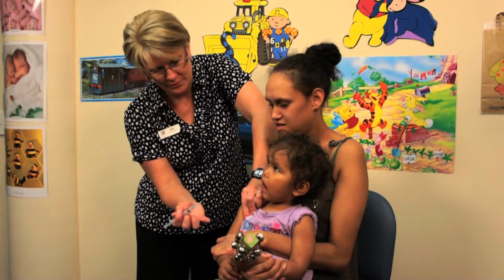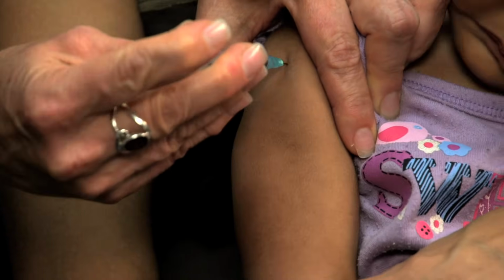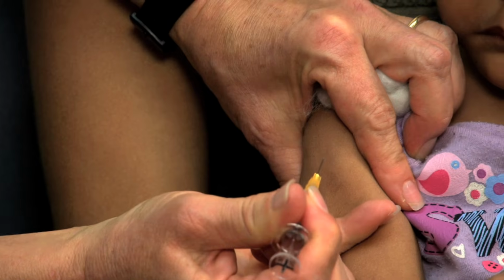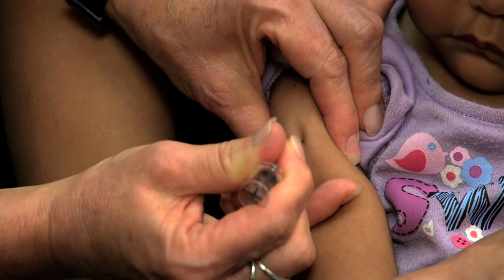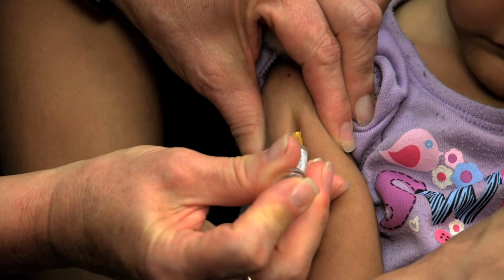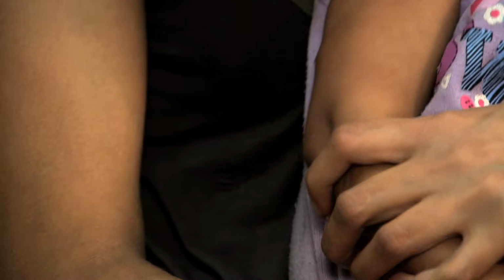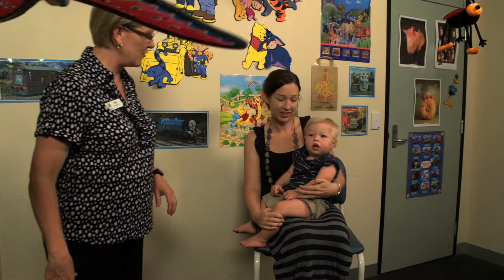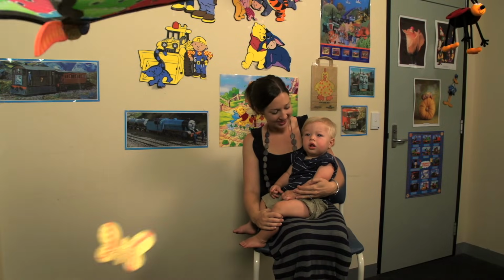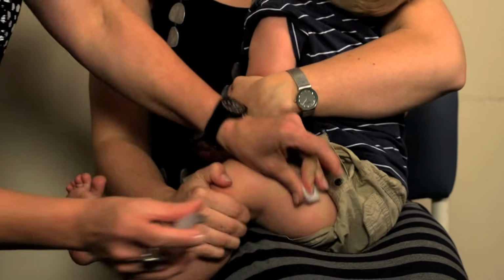For young children, when 3 or 4 vaccines are to be given and the deltoid muscle is adequate, a second injection can be given into each deltoid muscle as long as it is separated by 2.5 centimetres from the initial vaccine. This may be with an 18-month or 4-year-old child, as they would have a larger deltoid muscle mass for 2 vaccines. If the deltoid mass is too small, the vastus lateralis in the thigh is an alternative site. If you do inject into this site, make sure you give the least locally reactogenic vaccine so the leg mobility is not greatly impaired.